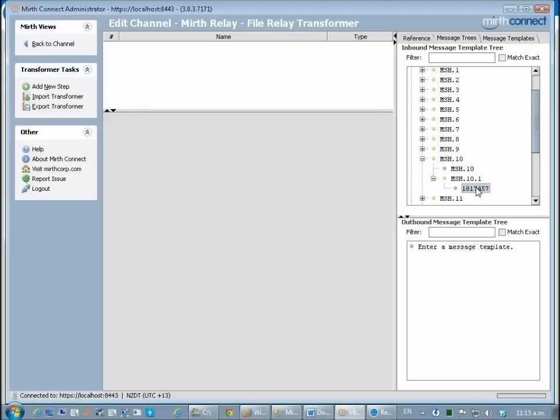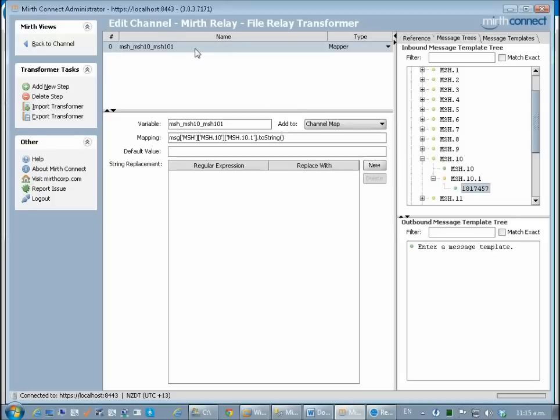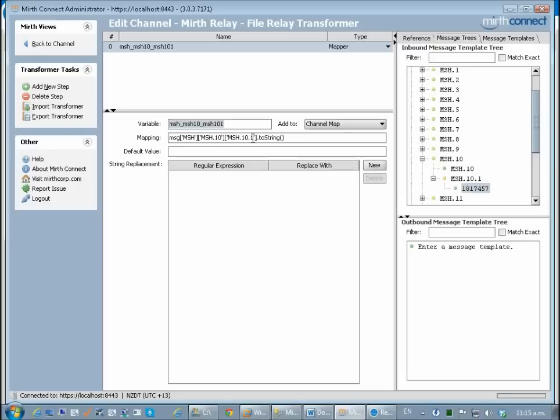I expand this out as far as I can until I can see the number which Mirth has transformed from the message template I pasted in. I can just drag that across and it's now created a variable which I'm going to copy the name of which basically gets its value from MSH 10.1, the message control ID.